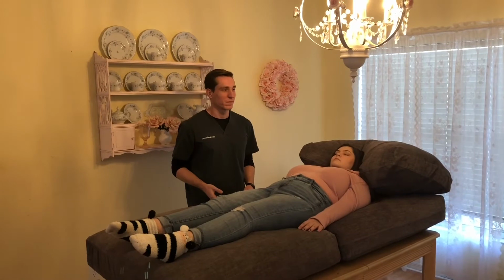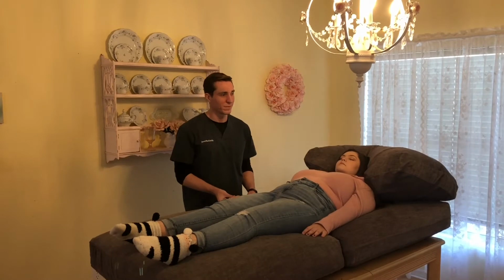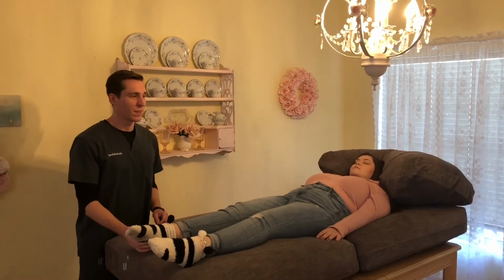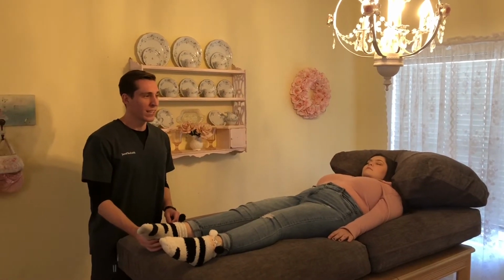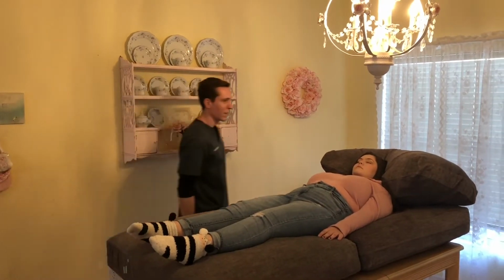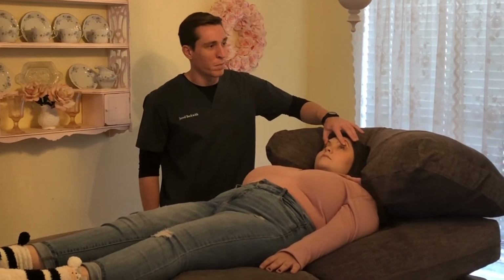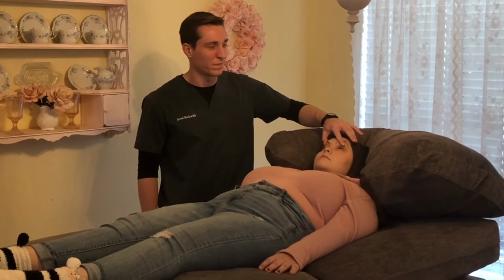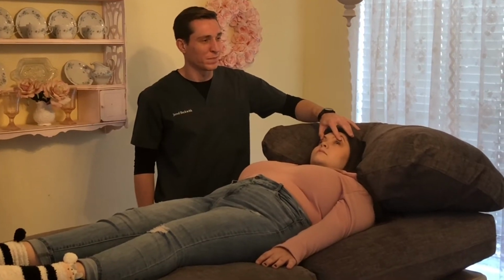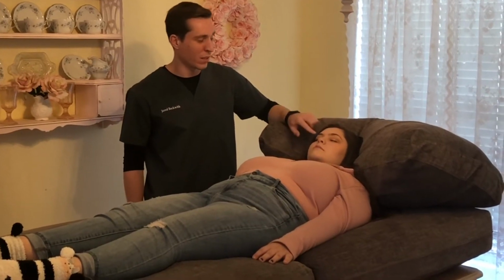Label. Right arm stimulation. Annotation saved. Label. Say annotation. Right leg stimulation. Annotation saved. Label. Say annotation. Passive eyes open. Annotation saved. Label. Say annotation. Passive eyes closed.